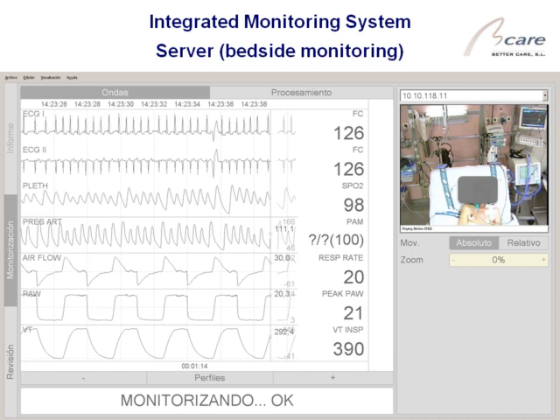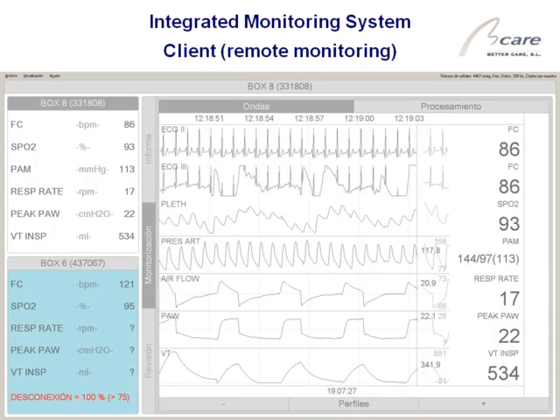We have information on what's going on over a whole day, with several patients at the same time. This is online, but we can also review it. We have information on any mistrigger, and on any breath with a stress index. Then we can review each one for teaching, or to analyze what happened during the night in certain situations that we want to examine.